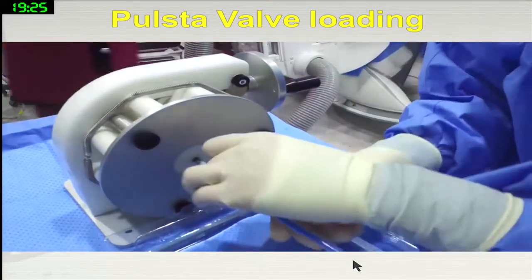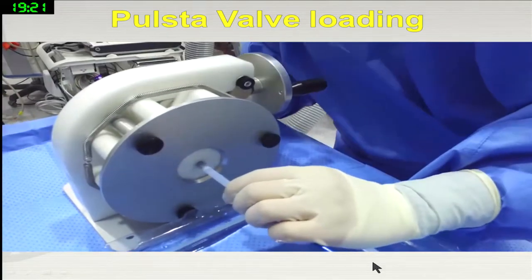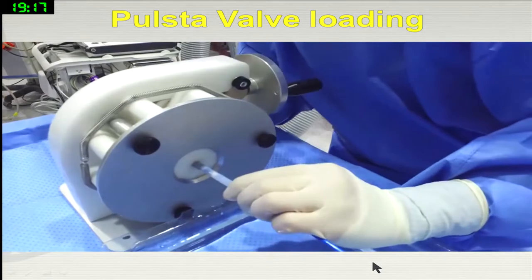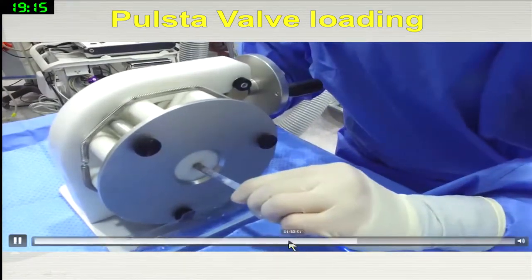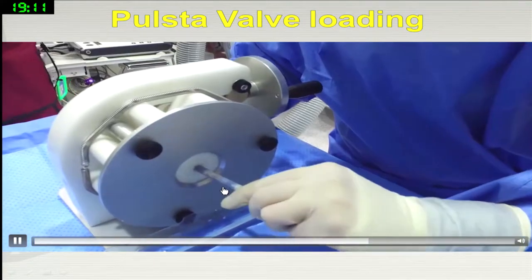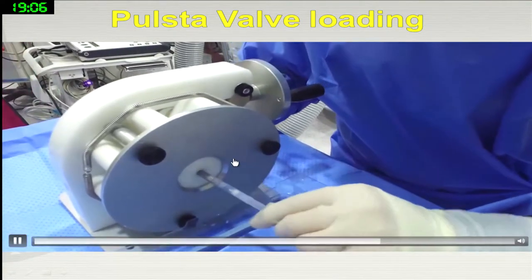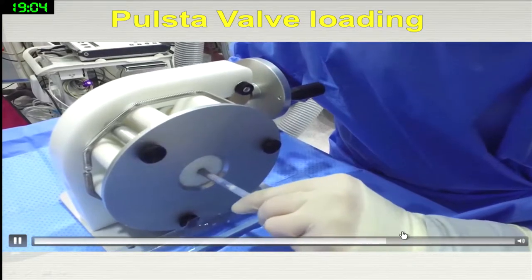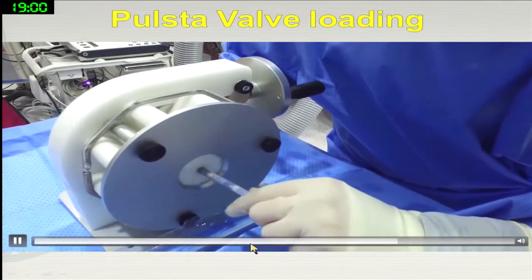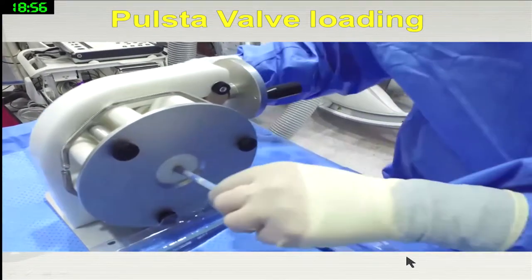It's the first time to introduce this valve loading procedure. So usually the valve is loaded in this delivery cable. Usually it takes 3 minutes. This is a 2 minute 30 second video. So from the beginning to the end, it takes less than 3 minutes.